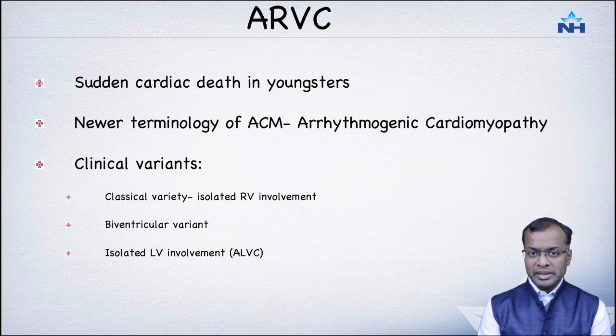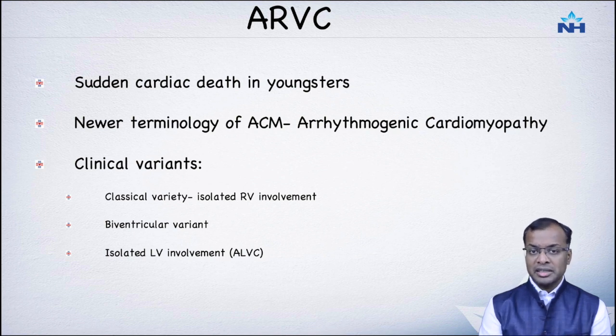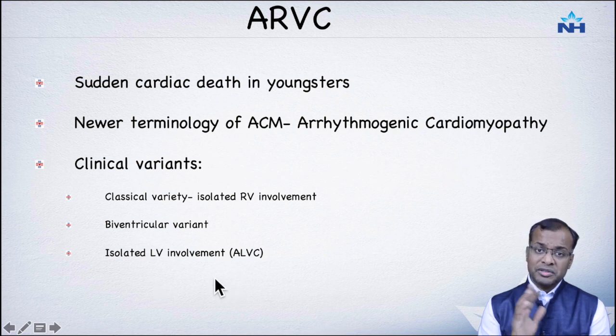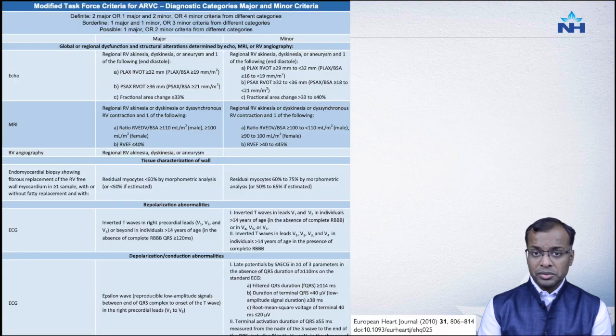In a small minority of cases, we started to see isolated involvement of the left ventricle, where the left ventricle primarily is involved while the right ventricle is spared. This often can be a big diagnostic challenge, especially to differentiate it from other infiltrative cardiomyopathies which tend to involve just the left ventricle. Now let's talk about the diagnosis and how do we diagnose this.